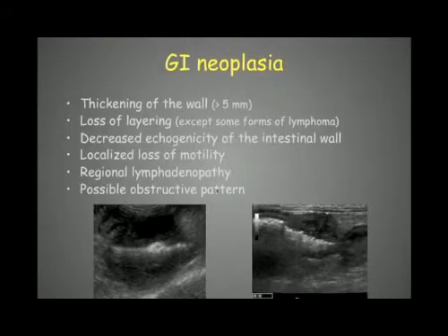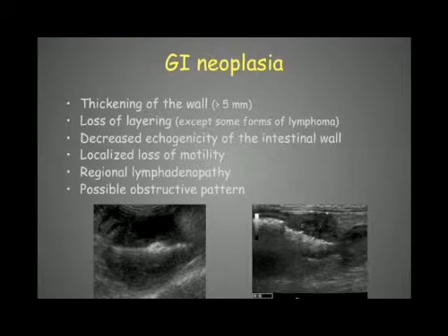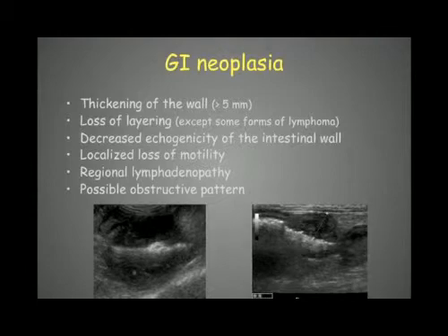Further examples show wall thickening greater than 5 mm and loss of layering. We can see a sharp transition where normal layering of the small intestine stops abruptly and a thickened lesion with no visible layering begins. There is also decreased echogenicity — these lesions are generally more hypoechoic — and localized loss of motility can be present.